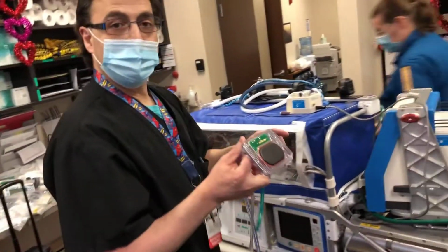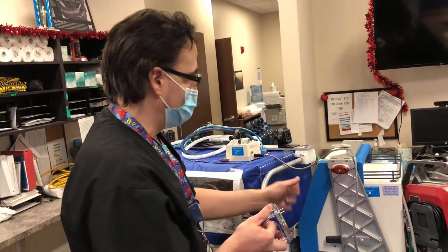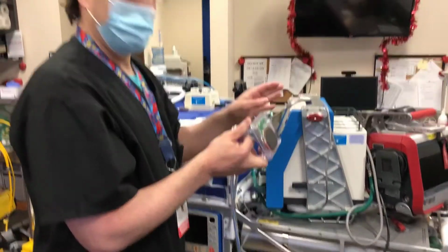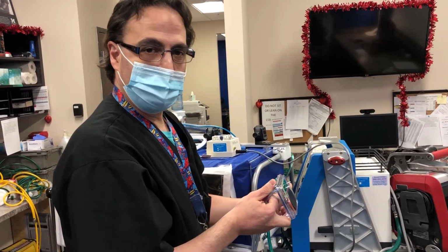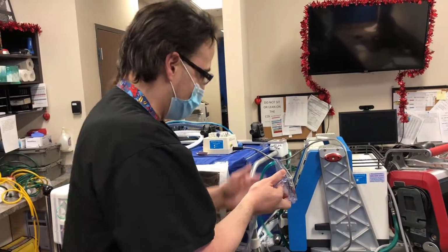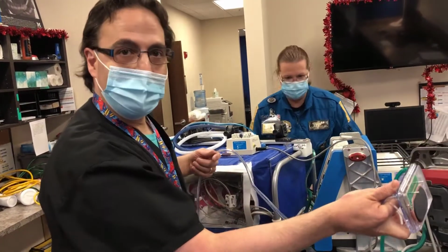I'm not going to set it up entirely, but once you have the equipment configured and securely fastened, you are able to reach in here. You have plenty of room to put your circuit on. If you have the nitric running through the jet, you have plenty of room to get your nitric injector module inside of that area there. And you have plenty of room and circuit length to make it into the Isolette.